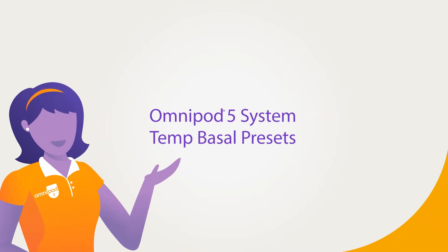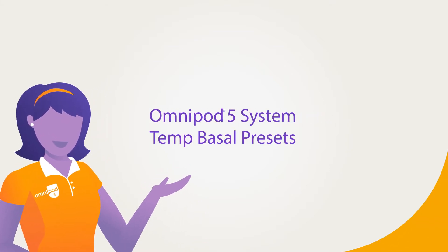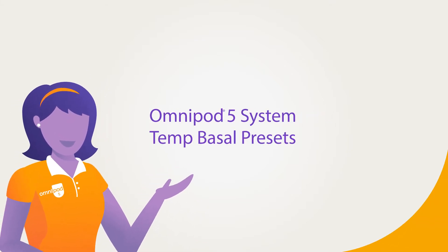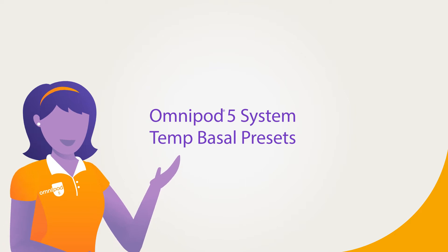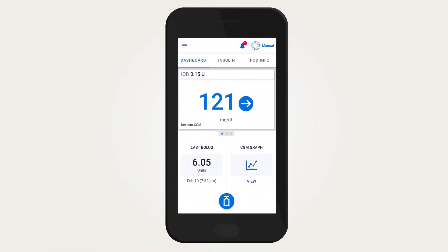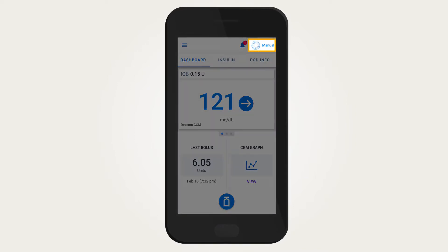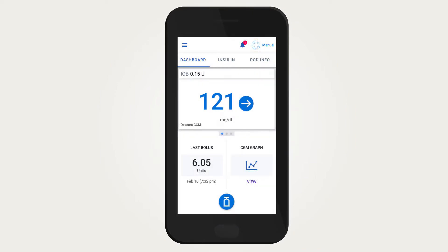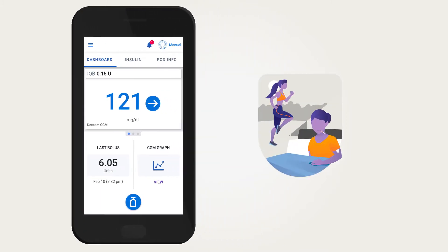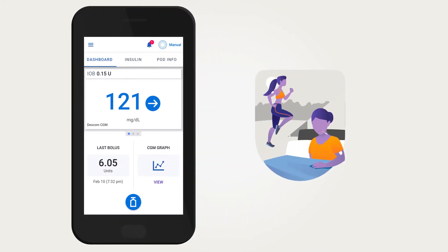Omnipod 5 Temp Basal Presets. In the Omnipod 5 system, creating and activating a temp or temporary basal preset is only available in manual mode. Temp basal presets can be set for often used temp basal rates, for example, exercise or illness.